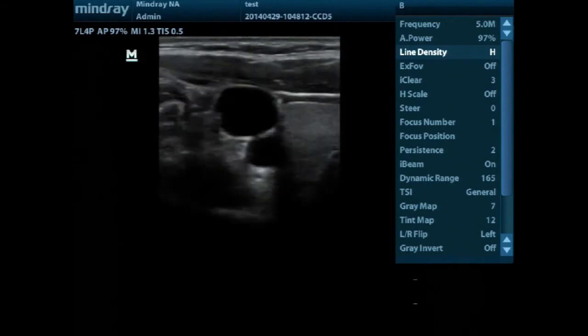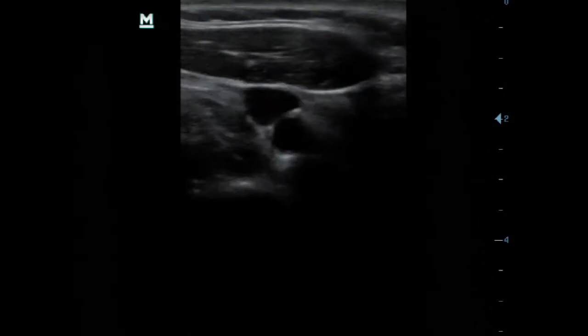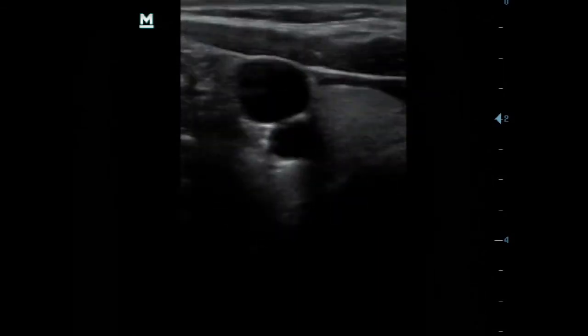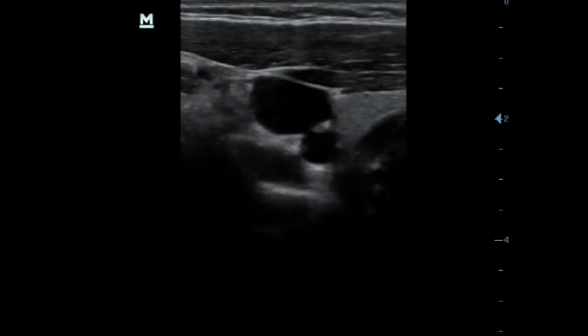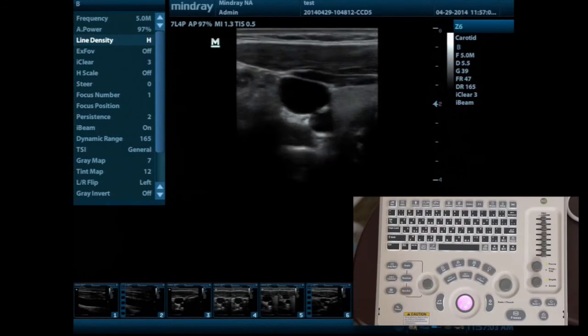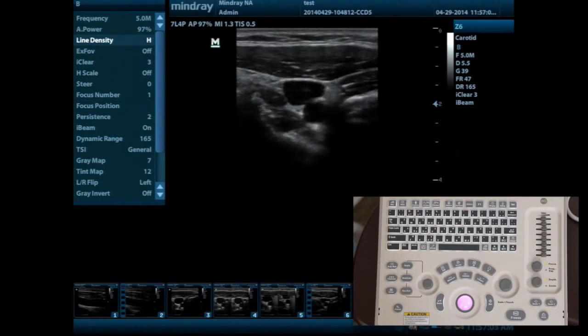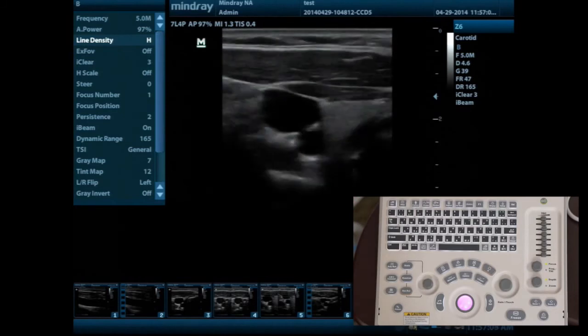And so this is like a medium, and then if you hit F1 again, the iZoom, then you go full screen. Oh, I see. And you have the ability to go between a normal size, a medium, and a full upsample to large screen. So if you press it again, you'll see that the F1 key becomes non-backlit orange and is back to where you see your images saved along the bottom and your patient information on the banner.